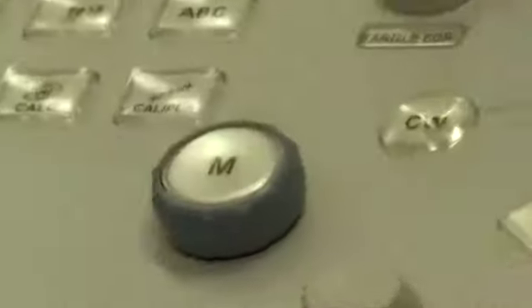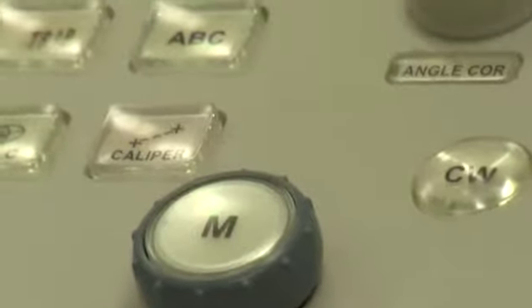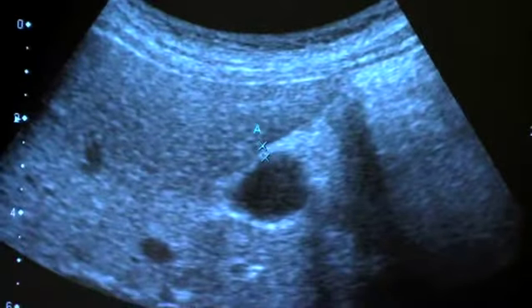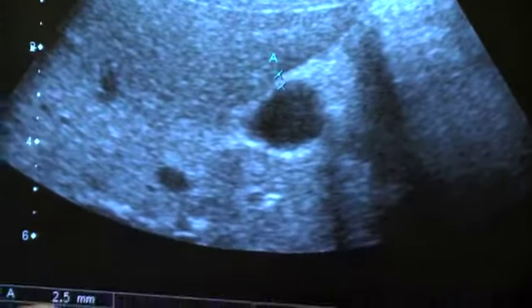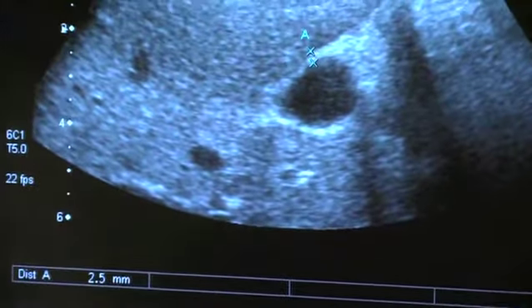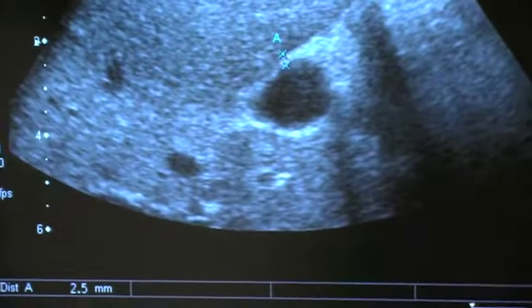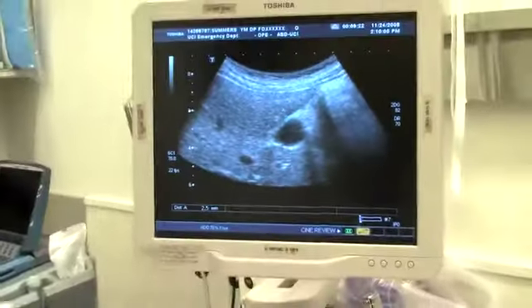And it'll bring up these calipers here that you can place on the wall of the gallbladder. You can hit set, and set again, and it puts the measurement down here, 2.5 millimeters. An abnormal gallbladder wall would be 3 millimeters or greater. That's a normal gallbladder wall measurement. You're also looking around the gallbladder for any anechoic fluid collection or pericholecystic fluid.